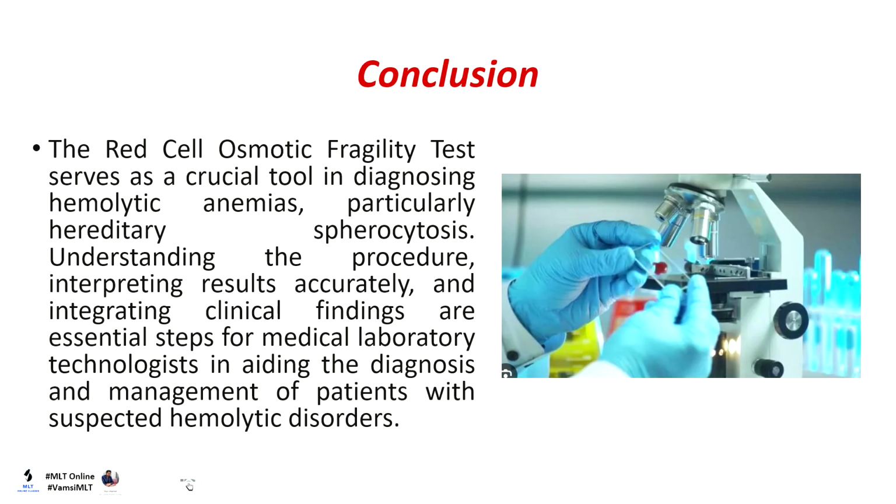Conclusion. The red cell osmotic fragility test serves as a crucial tool in diagnosing hemolytic anemias, particularly hereditary spherocytosis. Understanding the procedure, interpreting results accurately, and integrating clinical findings are essential steps for medical laboratory technologists in aiding the diagnosis and management of patients with suspected hemolytic disorders.